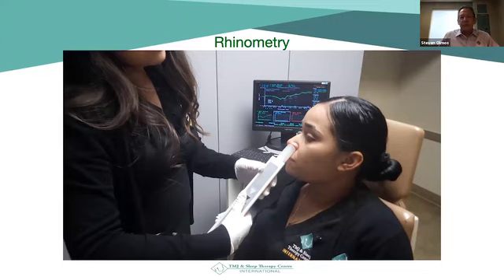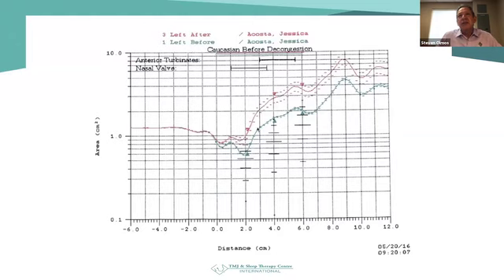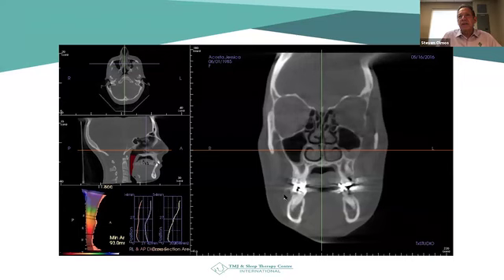So to understand problems of the nose, you can look at an x-ray, you can see it's obstructed, but can you change that? Is this osseous structure going to not completely block the airflow, or is it soft tissue that you can change? Well, by using rhinometry, which is the sonar to be able to measure the volume of the nose, then we can discern that. So here's a graph. The lighter blue is the baseline. This would be the inferior turbinates, middle turbinates, and superior turbinates as you're going back through the nose. And so there's not a great difference after spraying this person's nose. There's a small increase. But because people channel right to left, you'll see a greater increase on one or the other side, depending on where it is. And so we can actually measure how effective that treatment's going to be.